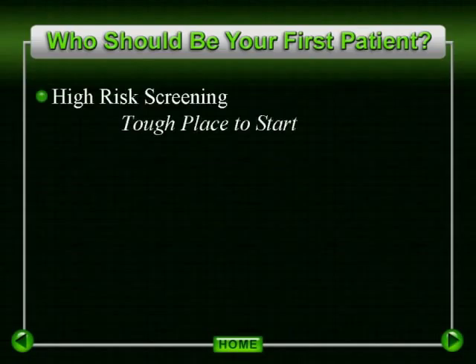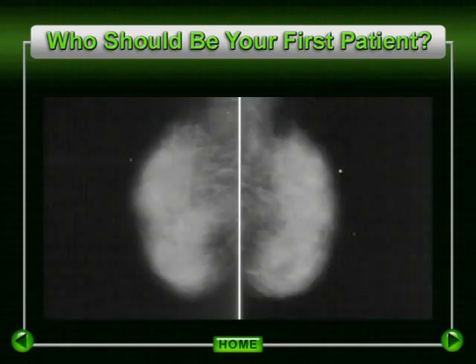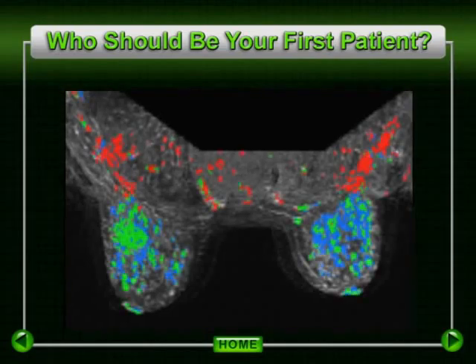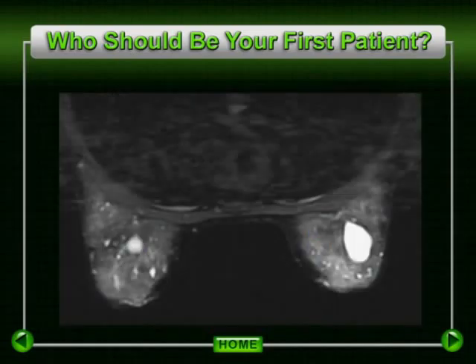The high-risk screening patient population is a population of patients that are most optimally left until after you have gained some experience, both with your program as well as with breast MRI interpretation. This population of patients is generally younger. They tend to have denser breast parenchyma, which is often hormonally more reactive and commonly associated with moderately prominent background fibrocystic changes. These can all result in moderately prominent degree of enhancement of the parenchyma, which can be difficult to evaluate, particularly when you have little experience.